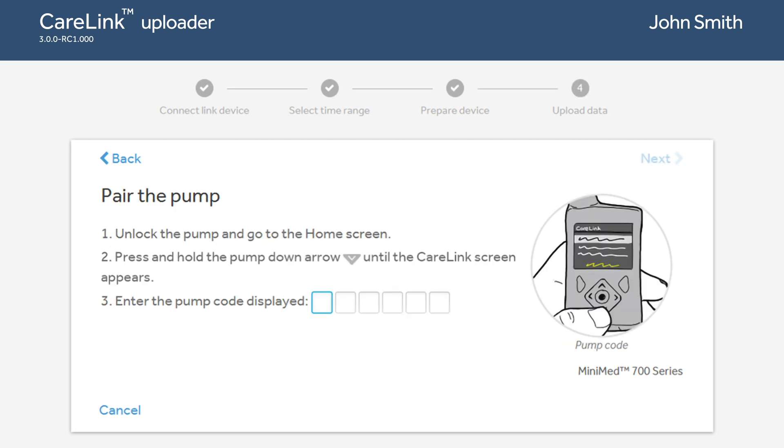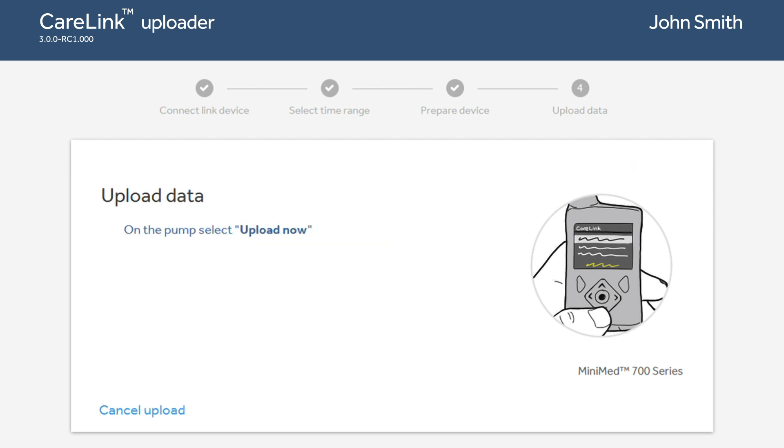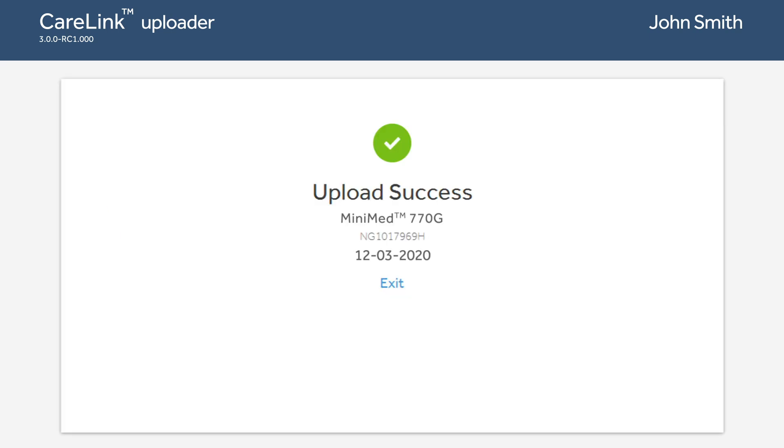Unlock the pump, then press and hold the Down button until the CareLink screen appears with a code displayed. Enter the code displayed on the pump. On the pump, select Upload Now and the upload will begin.